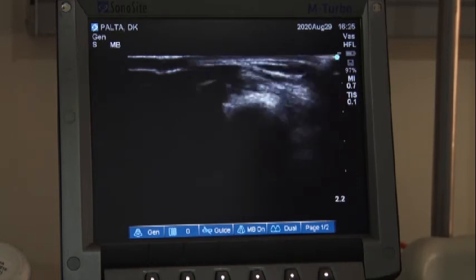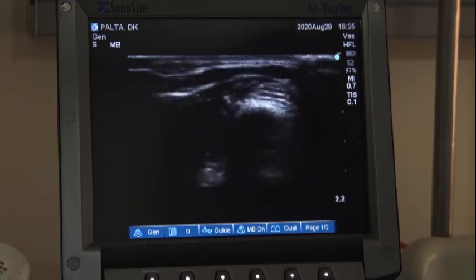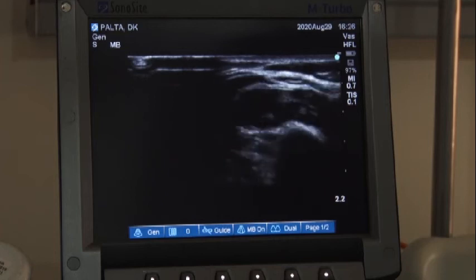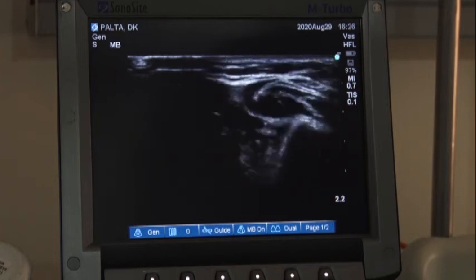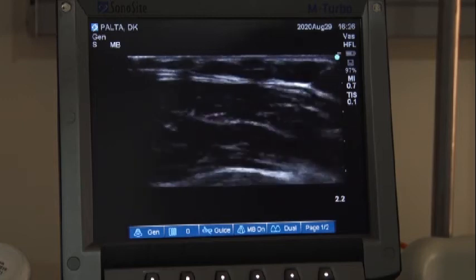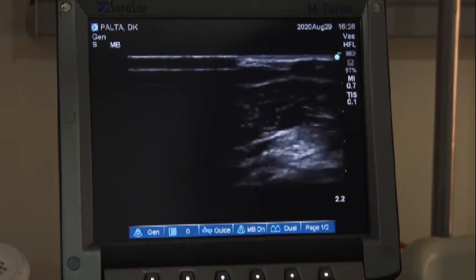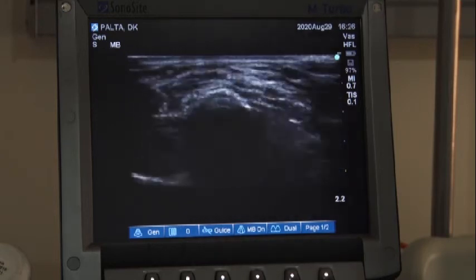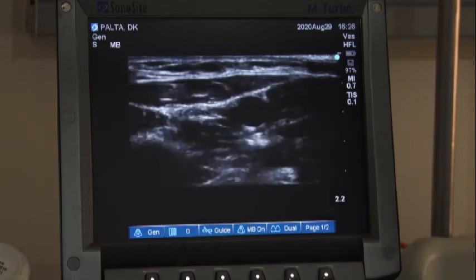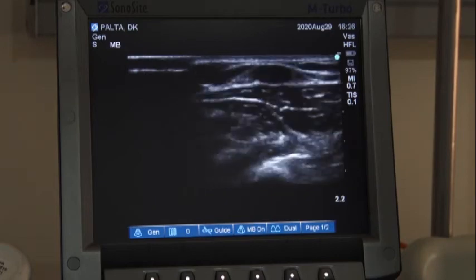So we'll follow the lateral vein, see where it is going. It's going on the lateral side and it's just ending here and joining the cephalic vein of the arm. And the main vein, this is the body of the AVF.